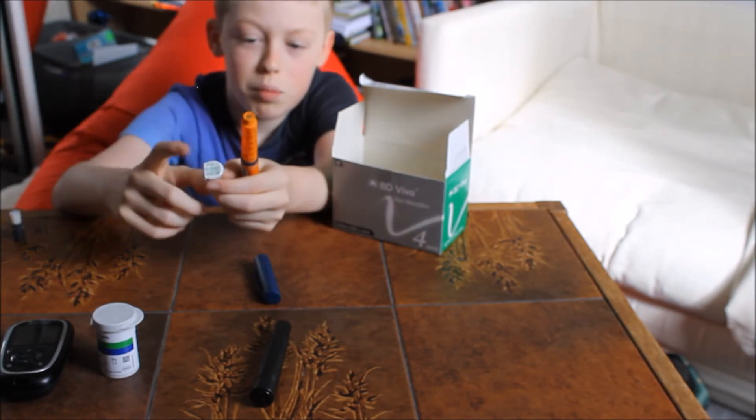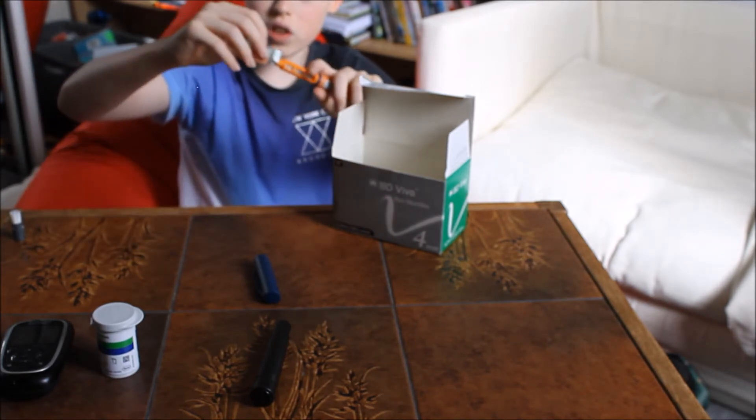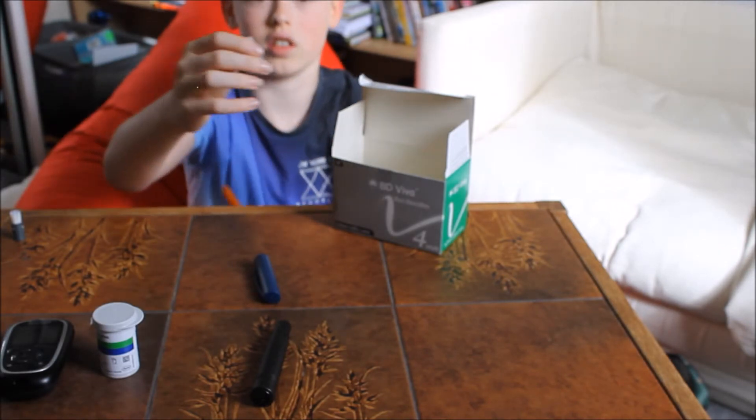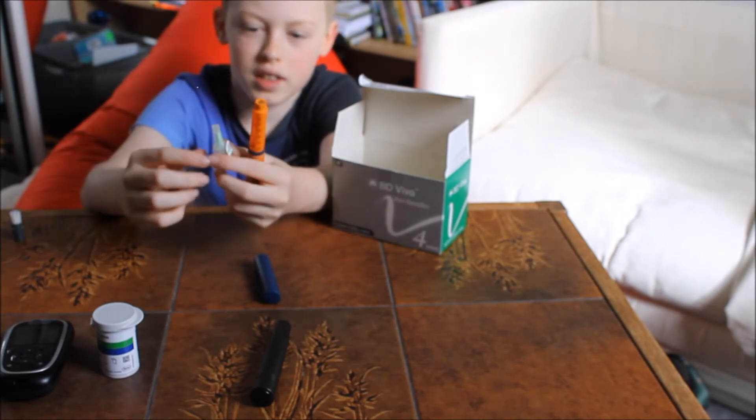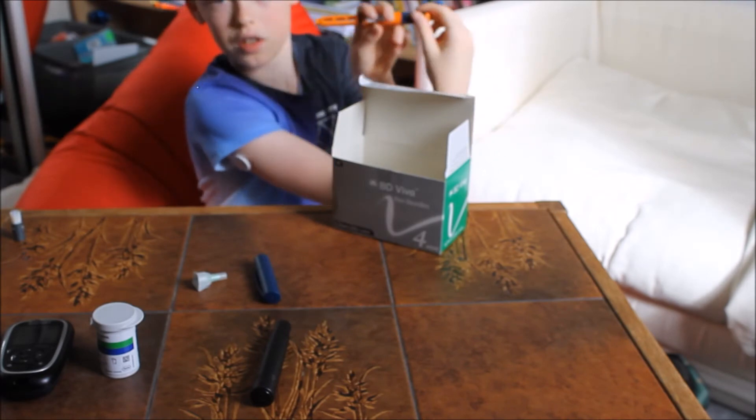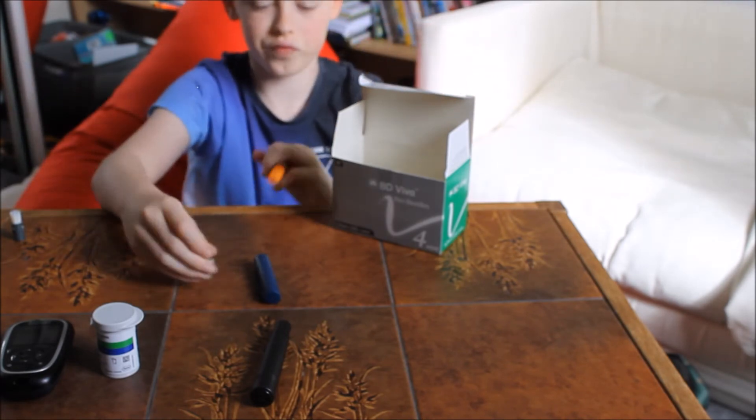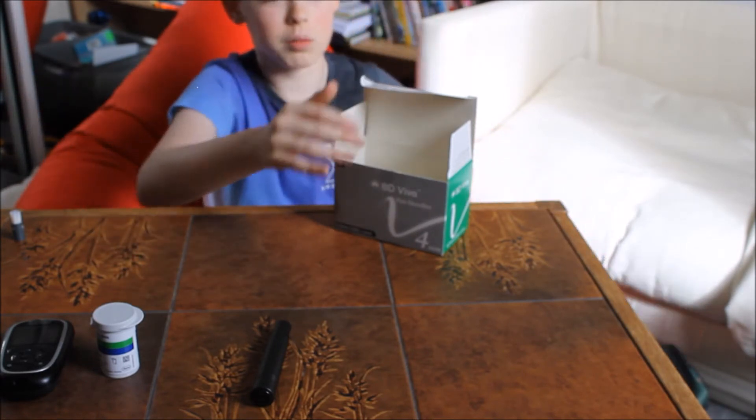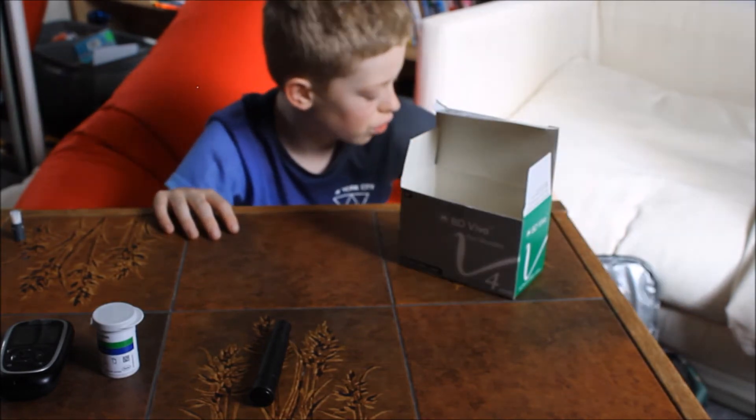I'm not going to do it right now, but you would usually take this bit off the top, screw it onto here, take this bit of plastic off, and then take that green bit off. Then you would be able to twist it up to however many insulin units you need and inject. I'm not going to do that right now.